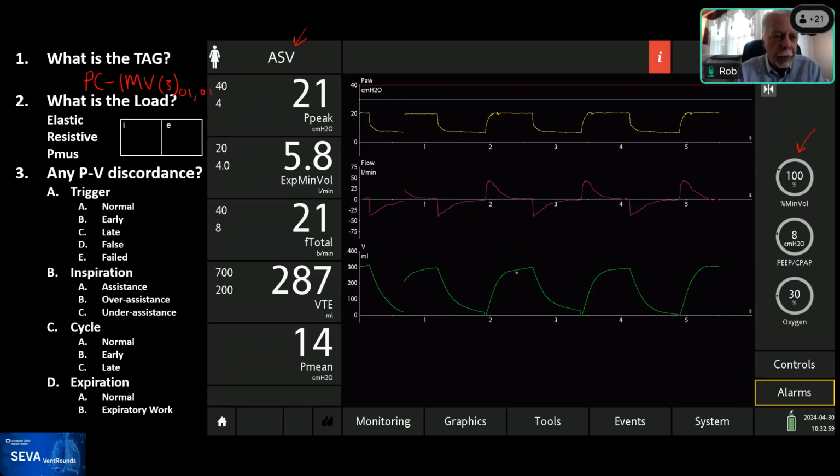So you know, for example, that the normal respiratory rate is about 10 breaths per minute. But if you get stiff lungs because of pneumonia, what happens? You take rapid, shallow breaths. And that's the brain's way of minimizing the power expenditure. So that's where adaptive turns into optimal. Now, the intelligent part, behind the scenes, if you read about how ASV works, you'll see that there are some safety rules imposed.